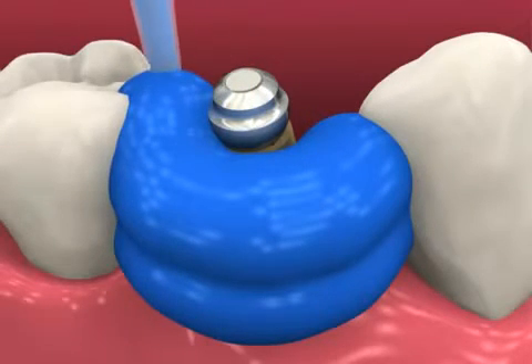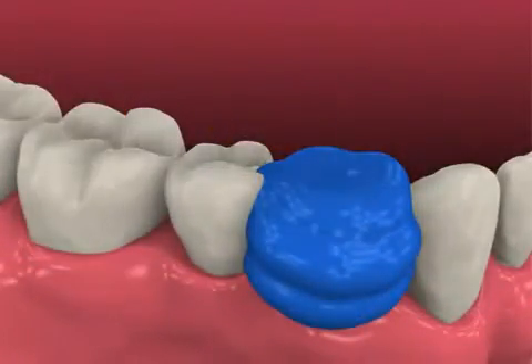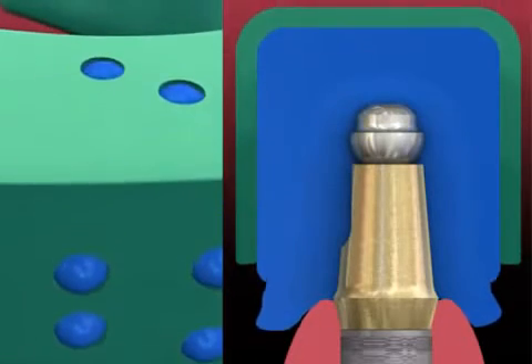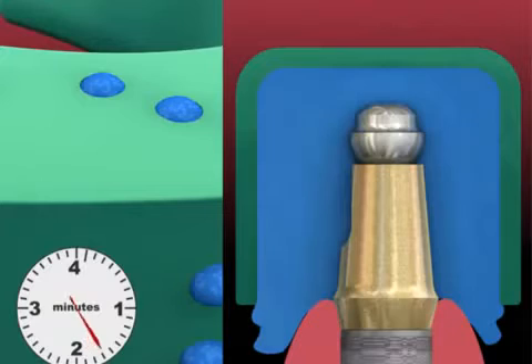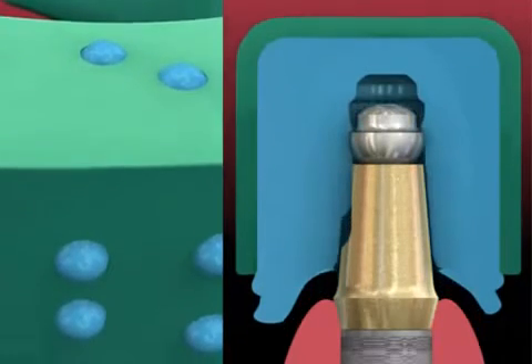Syringe elastomeric impression material around the abutment ball top assembly and record a full arch impression with a tray loaded with the same or heavier body material. After the material sets, carefully remove the tray.